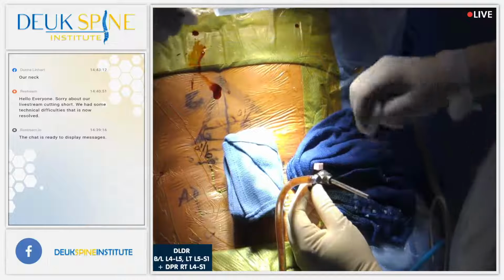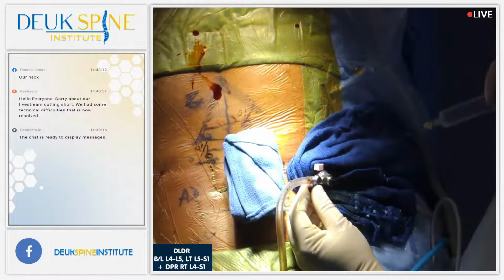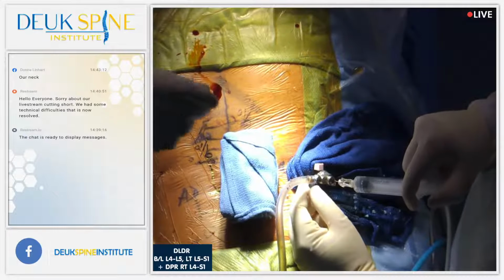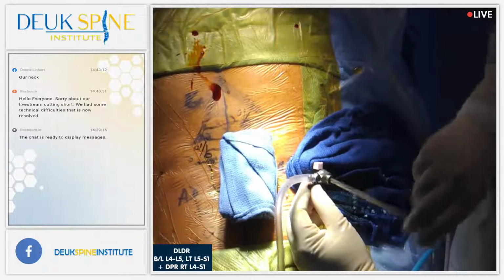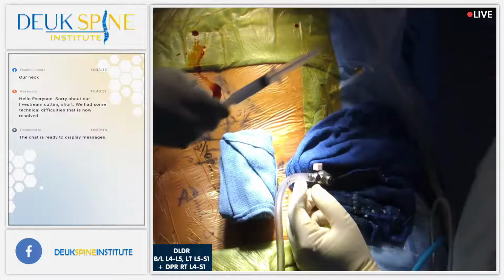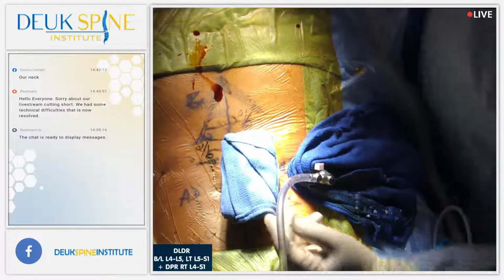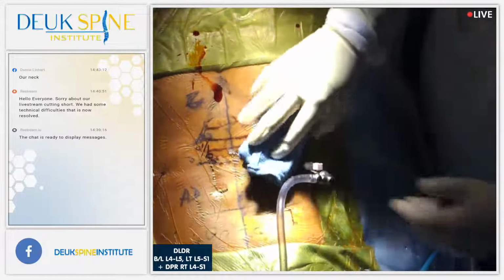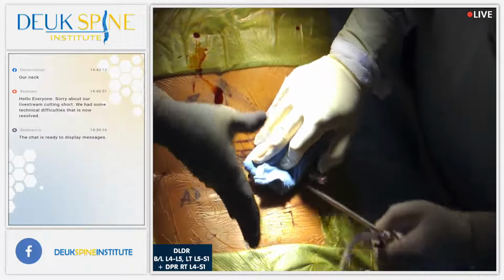Because we're doing a left 5-1 bilateral 4-5, that really counts as three discs. We call it three because there's three areas we're fixing, three tears. But it's on two discs, but since one of them is bilateral, we consider it three different areas that we're treating because it takes three times the work. And let's get that fluoro in.